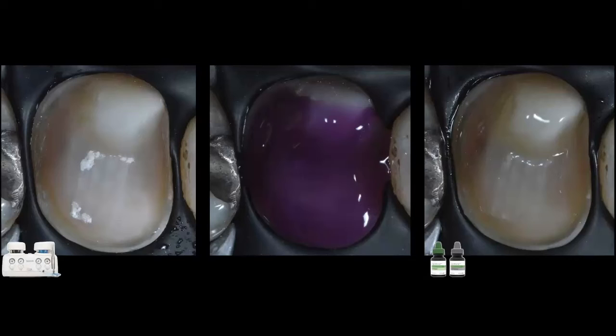I clean all that with this machine called AquaCare, where I use a combination of aluminum oxide, 29 microns at 1.5 bar, combined with distilled water. So it's a nice spray of water with the aluminum oxide incorporated within that water. And you can see how beautifully clean I was able to get the tooth. Now you're also seeing a little bit of my fibers exposed. That means that my final layer of composite on top of the fiber was somewhat thin. And when I was cleaning, you still get a little bit of abrasion caused by the microabrasion properties of the aluminum oxide. So a little bit of the fiber was exposed, but no worries.